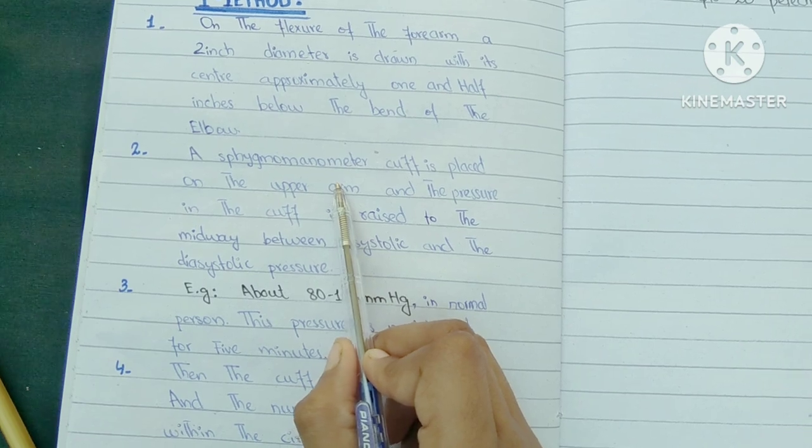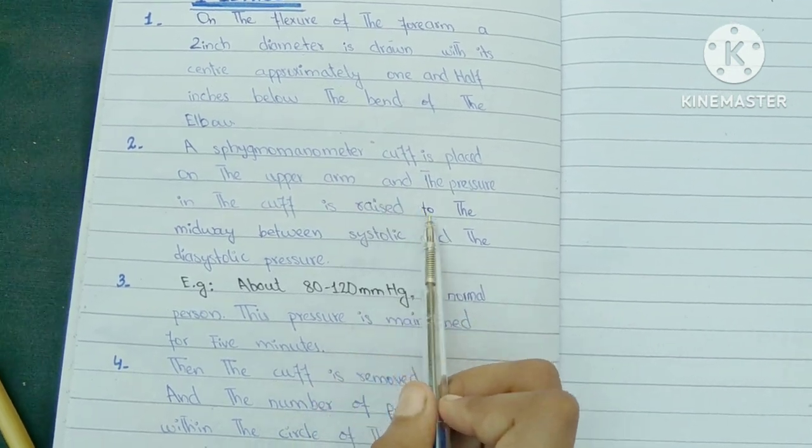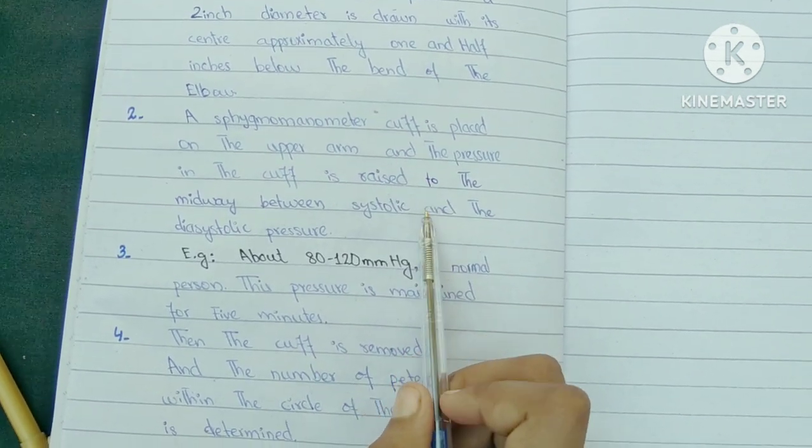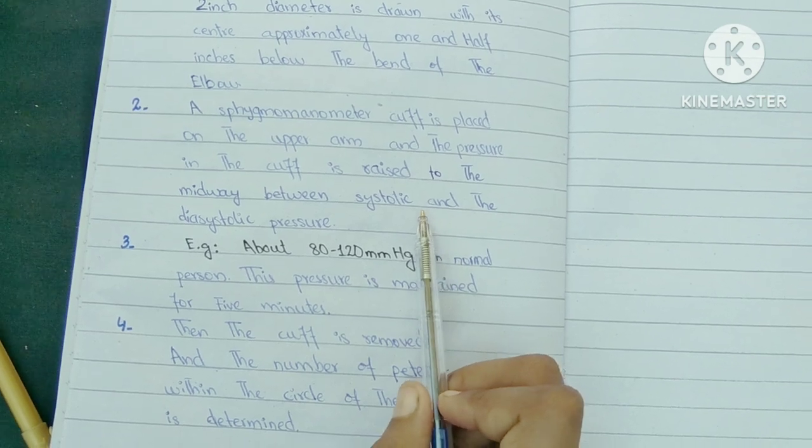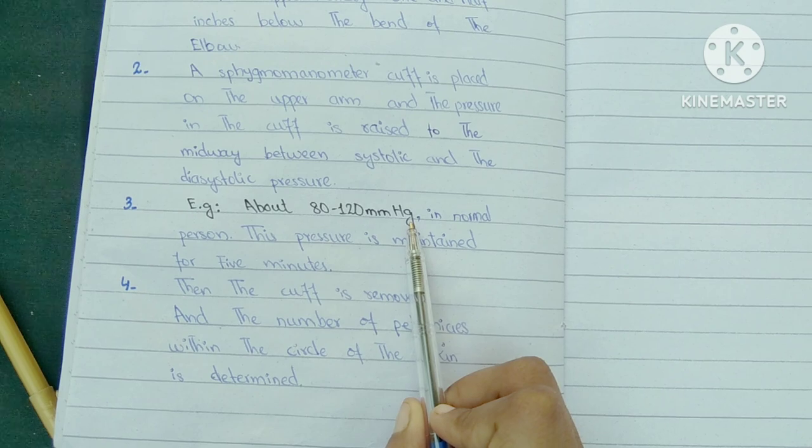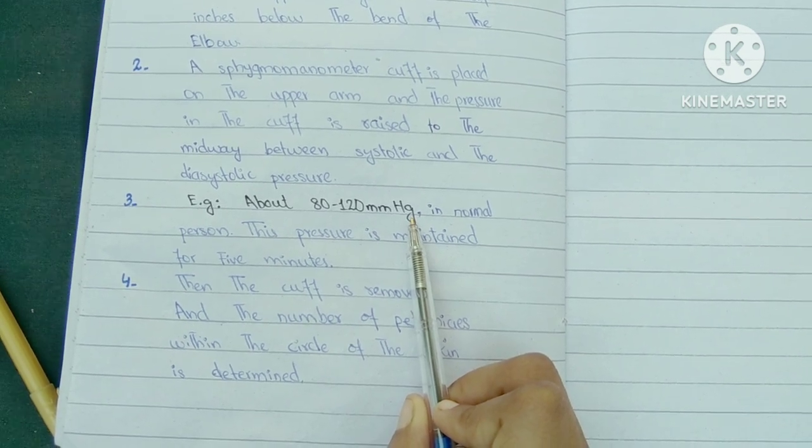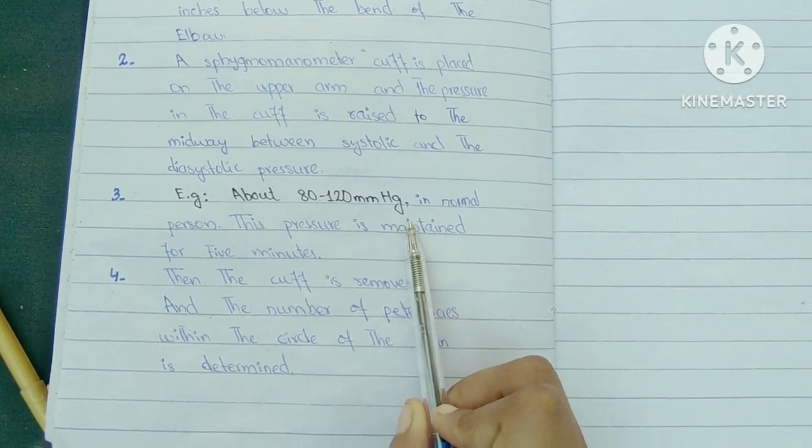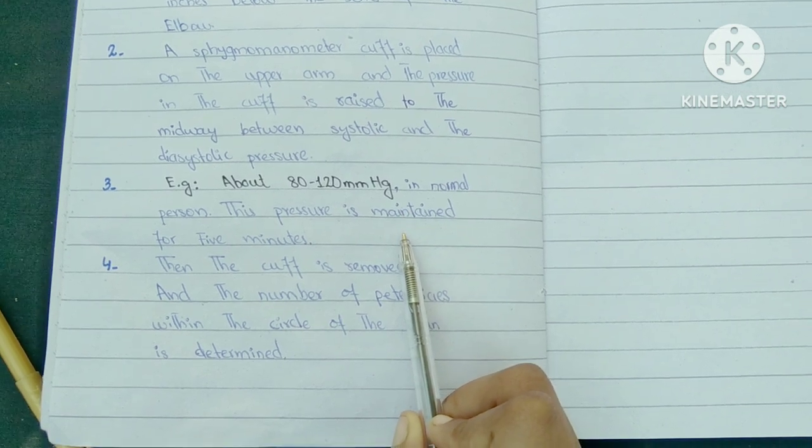Second, a sphygmomanometer cuff is placed on the upper arm and the pressure in the cuff is raised to midway between systolic and diastolic pressure. Third, for example, about 80 to 120 mmHg in the normal person, this pressure is maintained for five minutes.